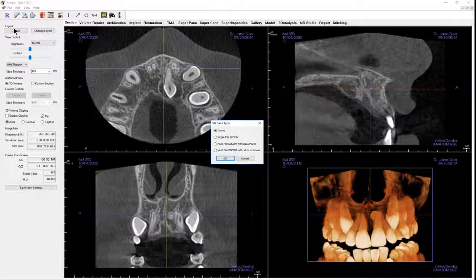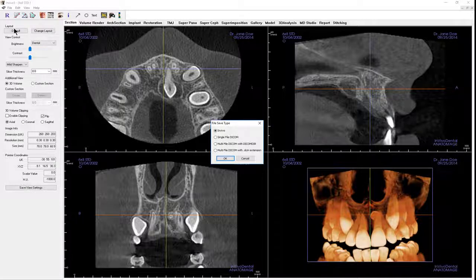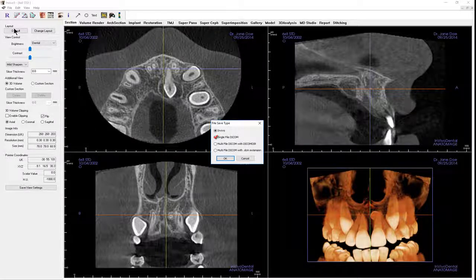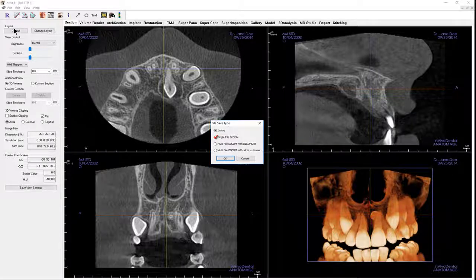All of these formats will save the scan and any changes made to it, and in vivo can read all three file types. The single file option will save the scan and any workups as a single file and is not generally recommended unless it is known that the recipient's program only reads single file DICOMs.